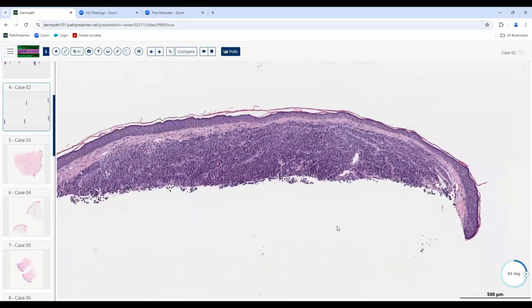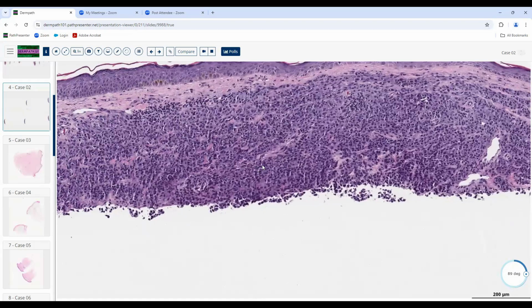And metastatic melanomas, if you see patients that have mets for melanoma, they can take several different histologic patterns, different clinical patterns also. They can appear as multiple small black dots that are papular, and so that might be what something like this would appear clinically. They can appear as little amelanotic red papules on occasion, and with no melanin in them. So that's possible with this one too. It doesn't really have a lot of melanin in here.